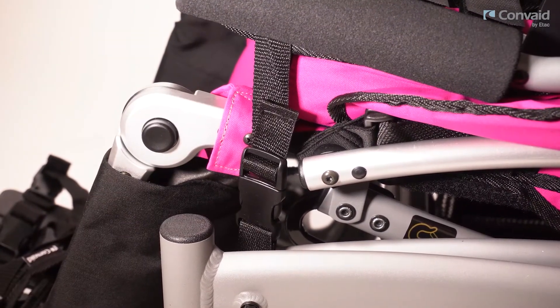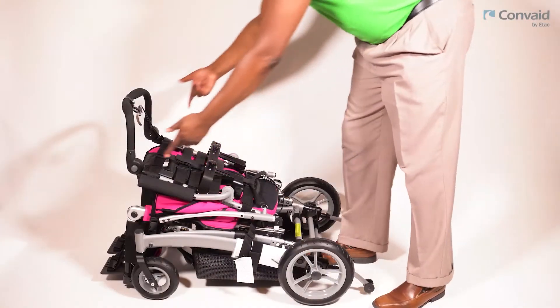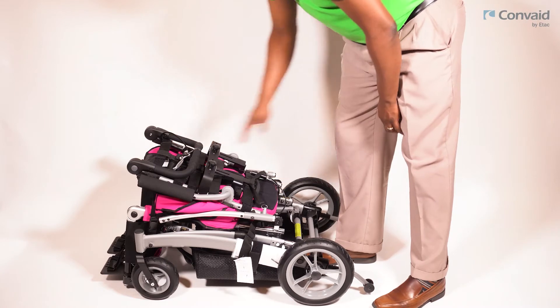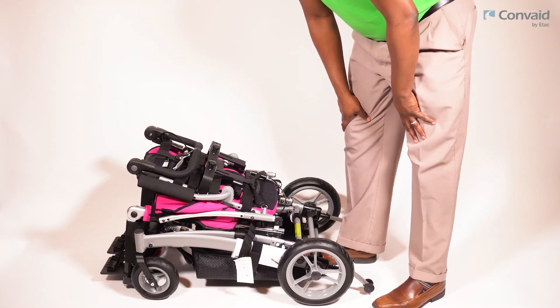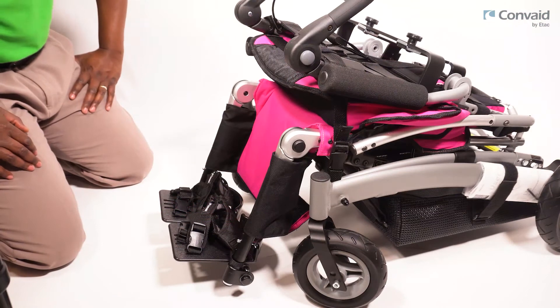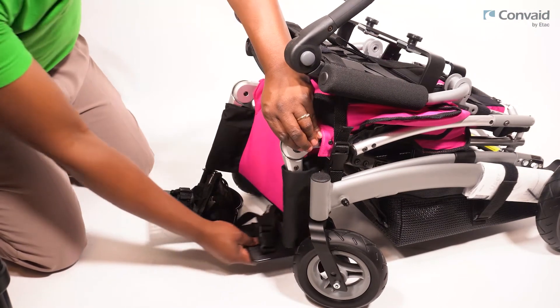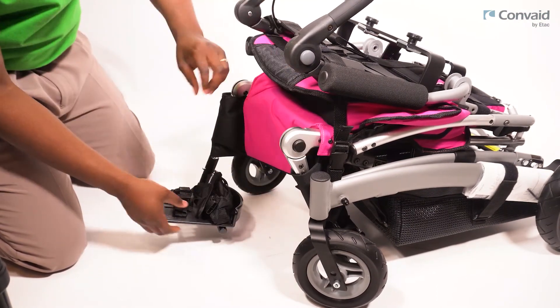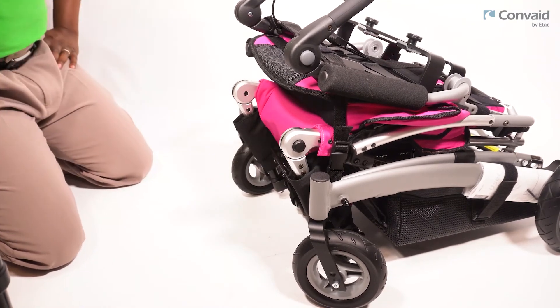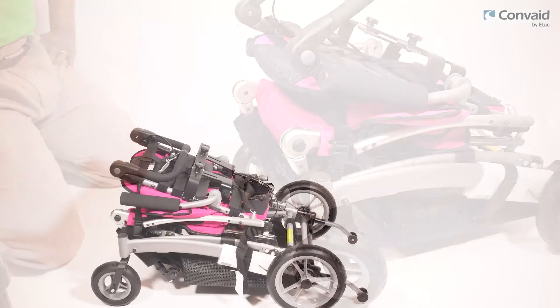Collapse your adjustable push handles, then fold your elevating leg rest. Your frame is now collapsed and ready to be transported.